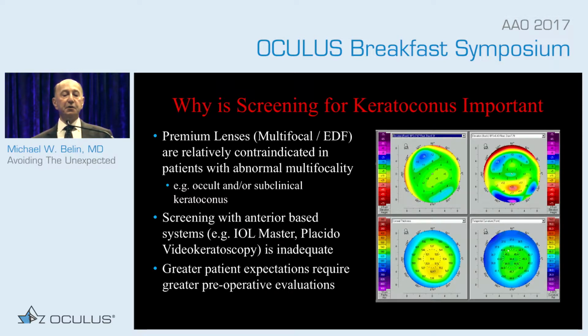Now, screening with anterior-based systems, an example, again, any Placido system, an IOL Master, is really inadequate, particularly now that we've gone to toric lenses and premium lenses. We have greater expectations of the patient, and they really require greater preoperative screening.